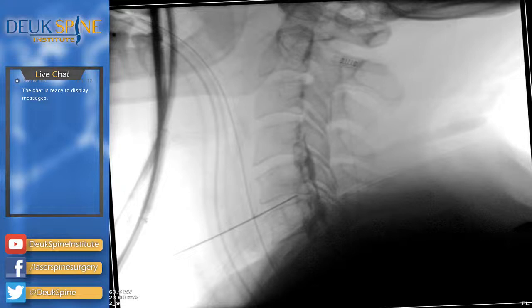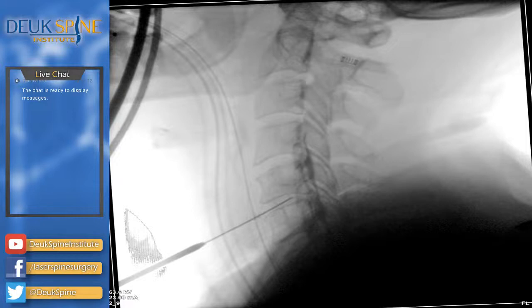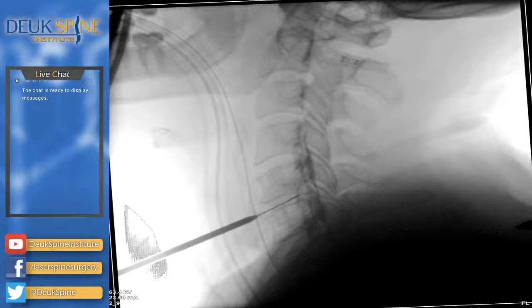Okay? All right. So now I need to advance this dilator over the guide wire down to the disc. I have to do that nice and slow. We take our time. We don't want to tear anything. This dilator is literally just spreading open things without actually cutting them. There's no cutting surface on the tip. It's quite literally just a spreader, not a cutter. Cutting actually damages tissue. Spreading doesn't.